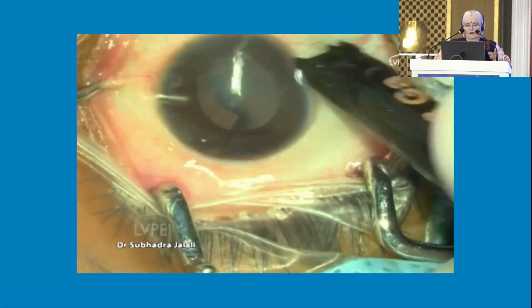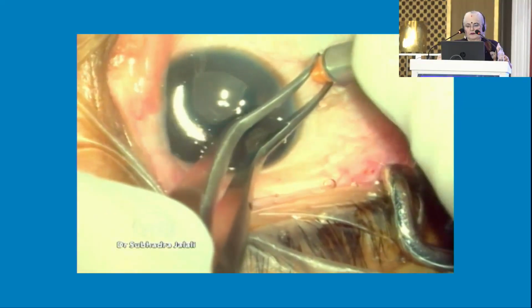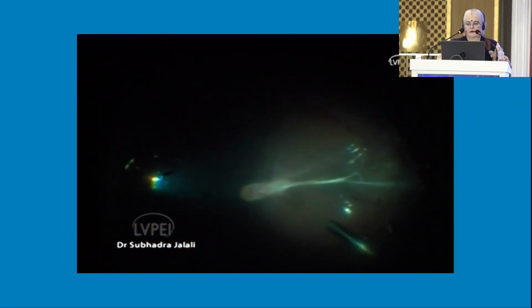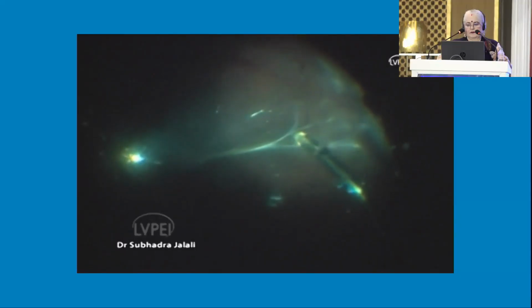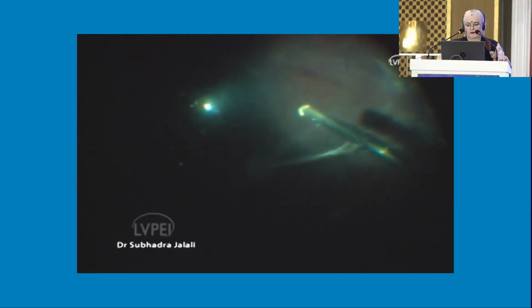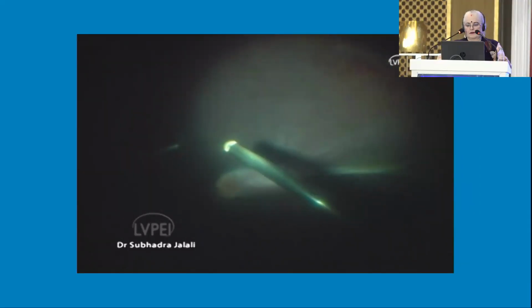This video is of a 3-year-old child where we are doing vitrectomy for FEVR fold. So I wanted to depict how to manage the retinal fold and the persistent fetal vasculature, which is very often associated with these folds in FEVR cases. As you can see here, there is some active vitreous hemorrhage, and that is the reason why we are operating this case.